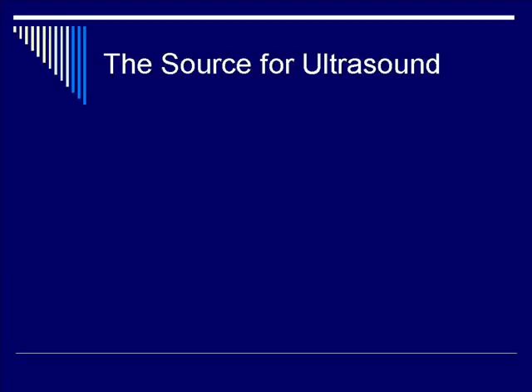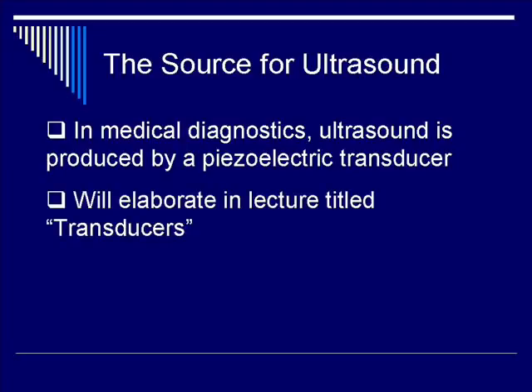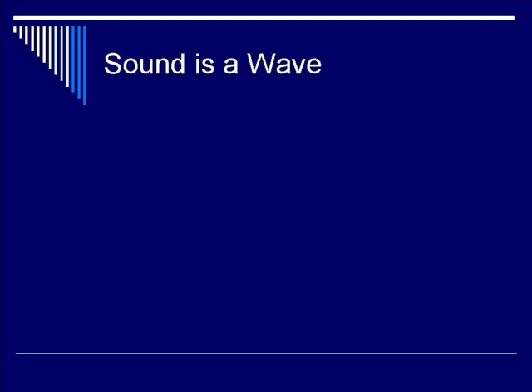How is ultrasound generated, one might ask? In modern medical ultrasound machines, a piezoelectric transducer is responsible for the generation of the ultrasound beam. In a future lecture entitled Transducers Physics, we'll go behind the phenomenon and explain in detail the piezoelectric effect. Sound is a wave with a defined speed, periodicity, frequency, amplitude, intensity, and direction.